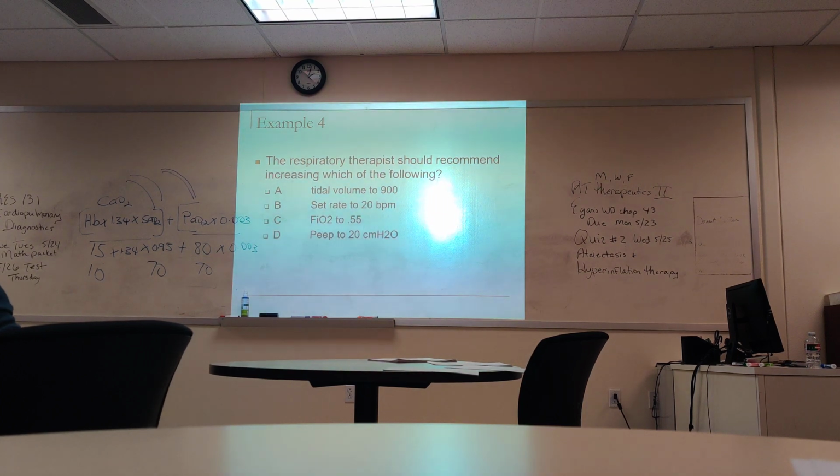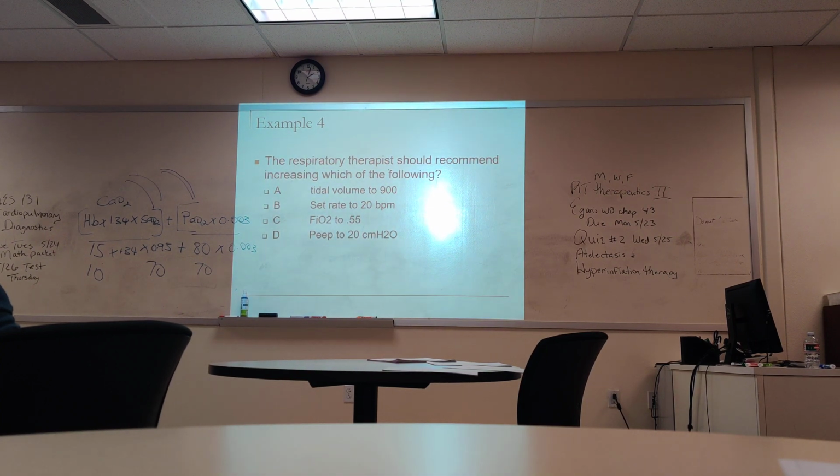What are we going to do to give more oxygen? D. D. Yeah, we increase PEEP to 20.